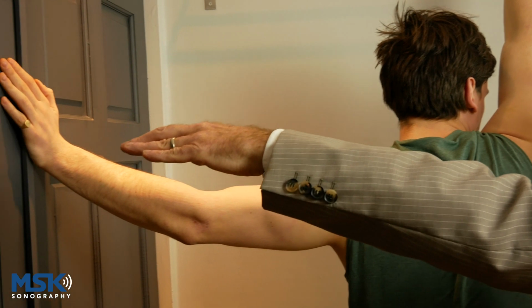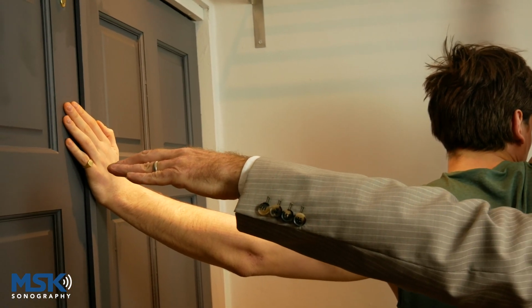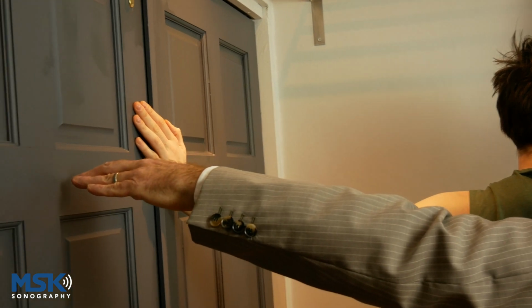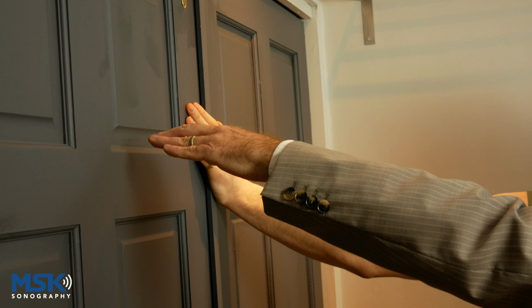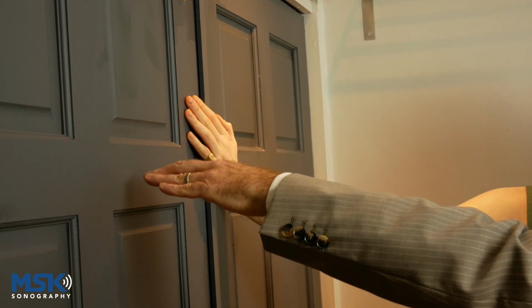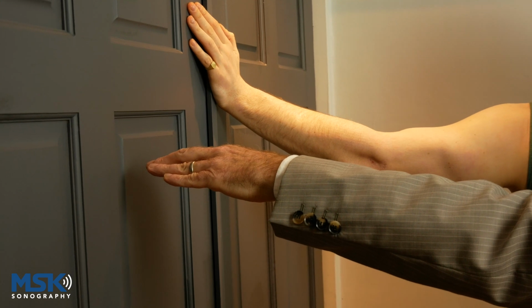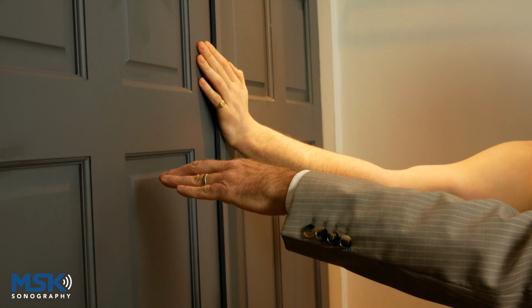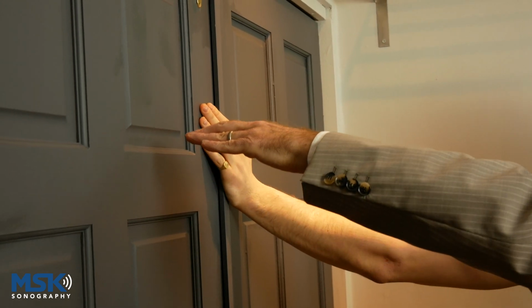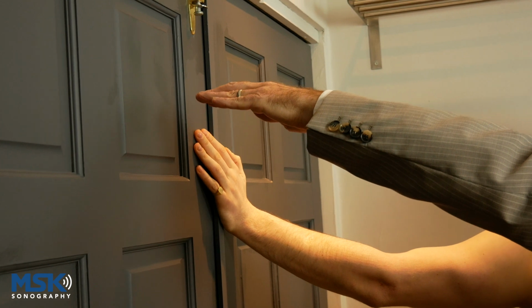We also have to capture the most distal aspect, and so we have to come right around the contour of the actual hip to capture that. And once we've caught those most distal fibres, we then keep them as perpendicular as possible. We go distally, capturing the head of the femur, which is distal to the actual attachment. We rise back up, keeping it in the same plane, capturing the tendons again, and then slightly more proximal to ensure you've captured the whole structure.